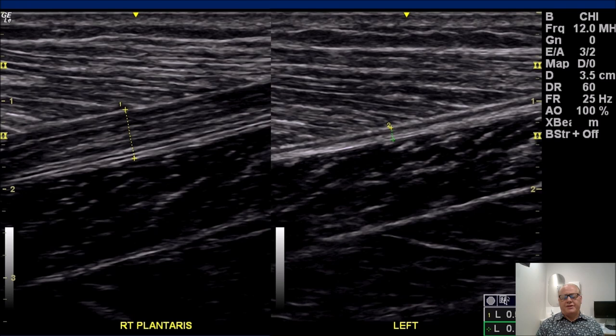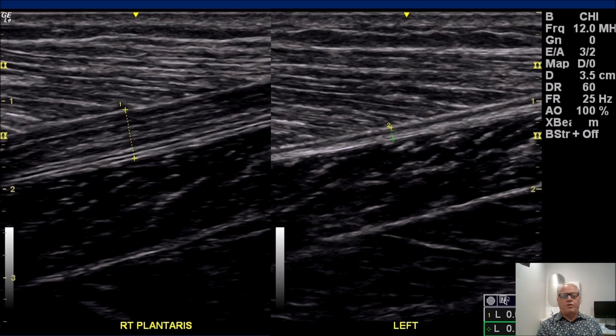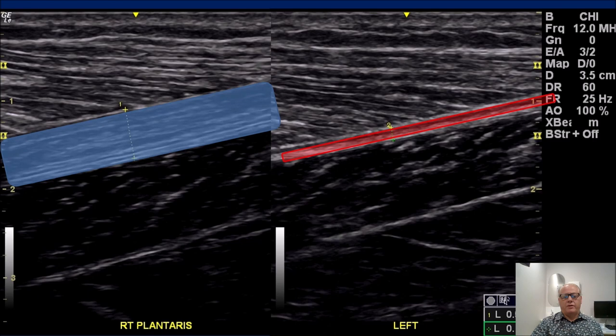Just as a little aside, not really the ankle, but we're going to talk about plantaris as well — often missed. When scanning plantaris, come from the Achilles tendon; you'll often see a thickened band on the medial side. Follow that up into the aponeurosis of the medial gastrocnemius and soleus. Chronic strains, partial ruptures, or complete ruptures that have healed will present as a thick band palpable on the medial side of the calf. This is a thickened plantaris.